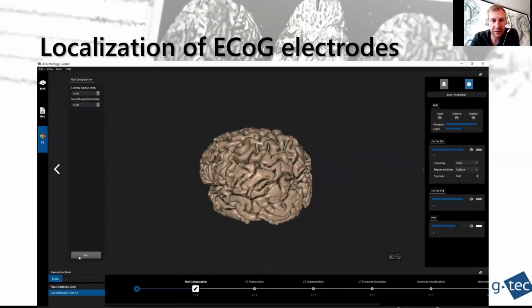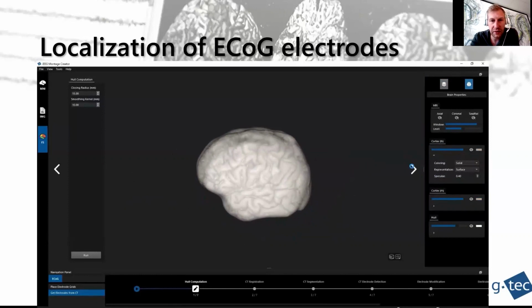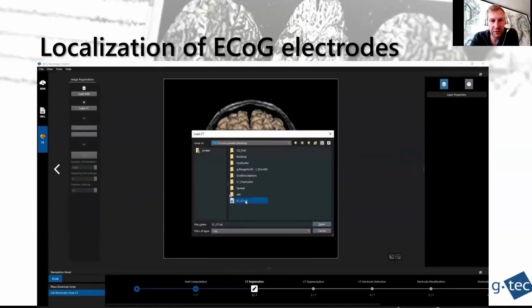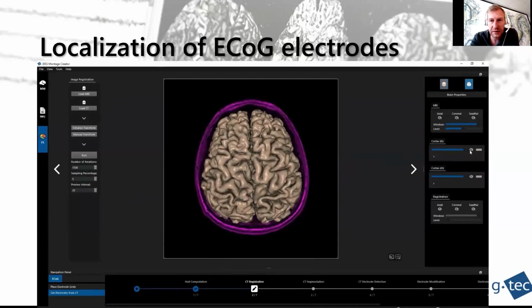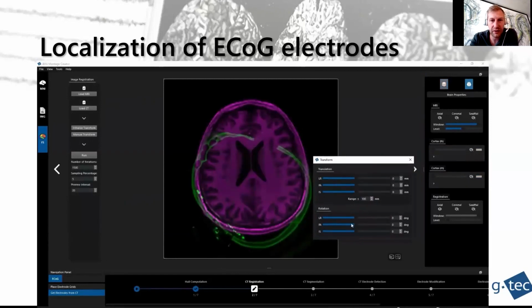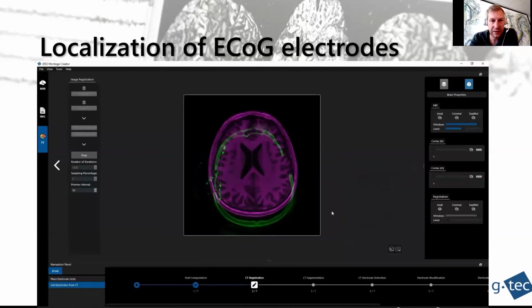We have the slice information of the MRI, and the first step is to compute a hull so that we can project the electrodes onto the hull so that they're in direct contact with the cortex. This is necessary because the electrodes are inside the skull when we implant them, and they squeeze the brain a bit so that it appears that the electrodes are inside the brain, but in fact they are on the cortex. So we need to correct this brain shift.